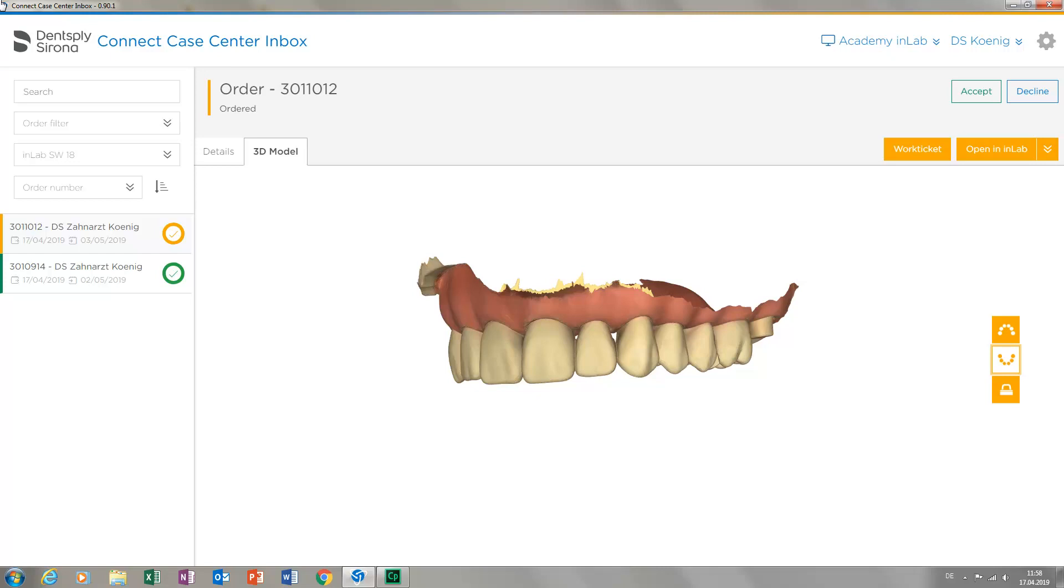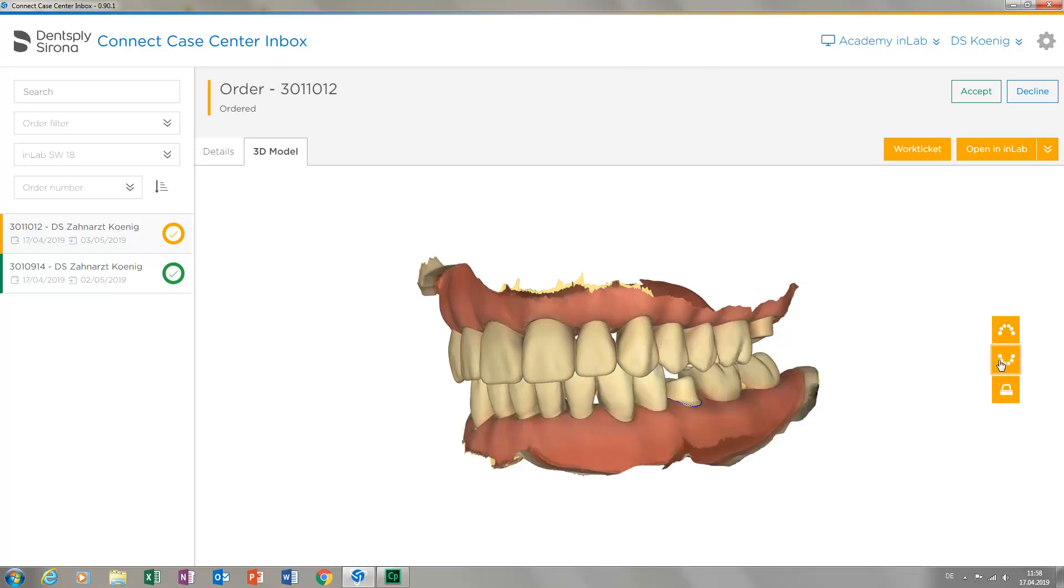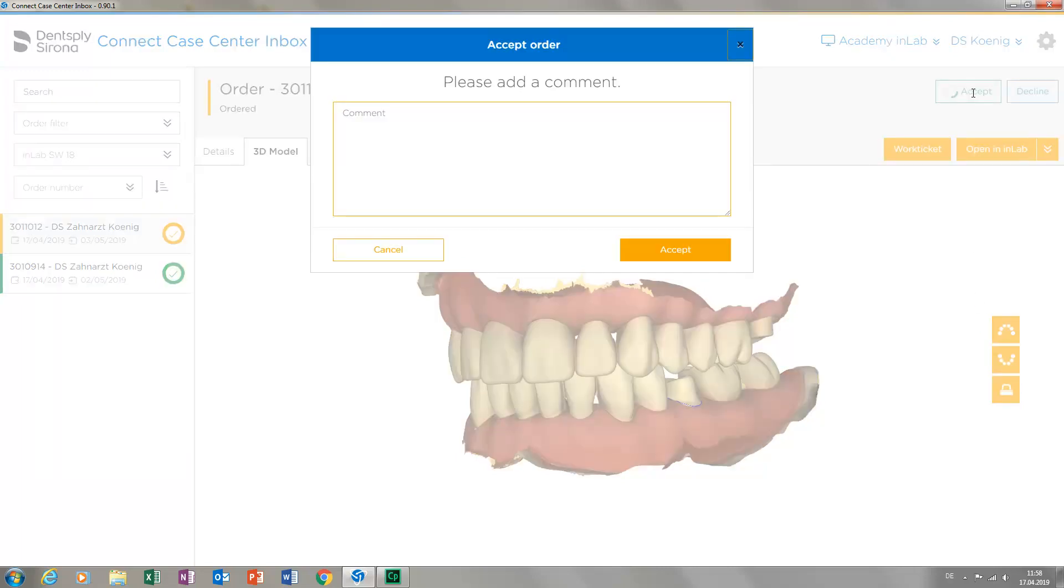After we have checked this, we will display the lower jaw again and accept the case. A new window opens with which you can provide feedback for pending questions to the ordering dentist or comments regarding the case.